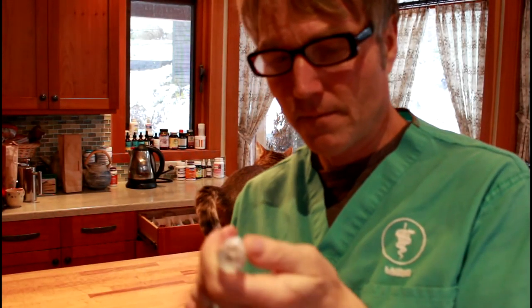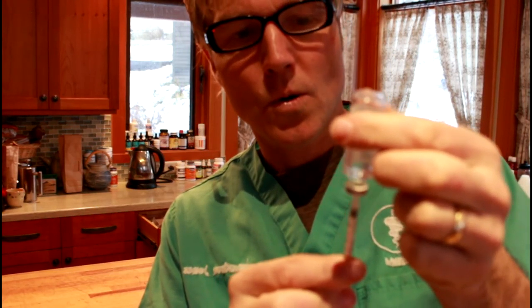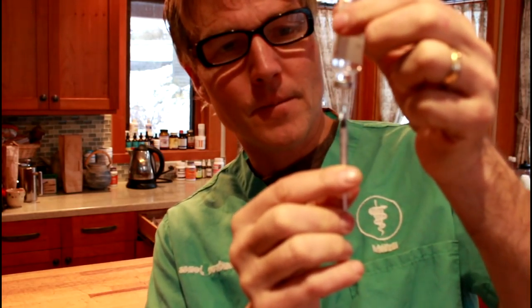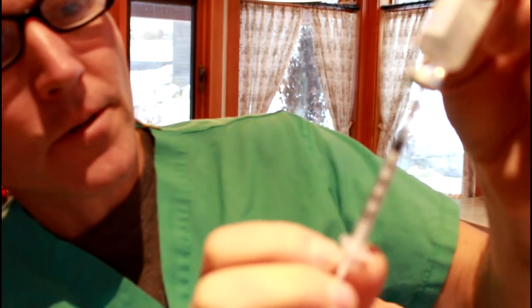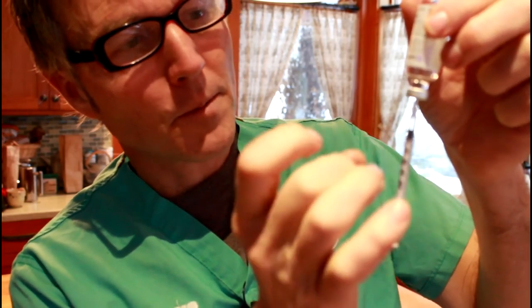This is our new sharp needle here. Murray's dose is quite small — he's on one unit twice a day. There are marks on the syringe that go up to 30 units. So I draw up to the one mark, and then with one hand holding the insulin bottle and the other hand flicking the syringe, I make sure there are no air bubbles in it and push it all the way up to the one unit mark.